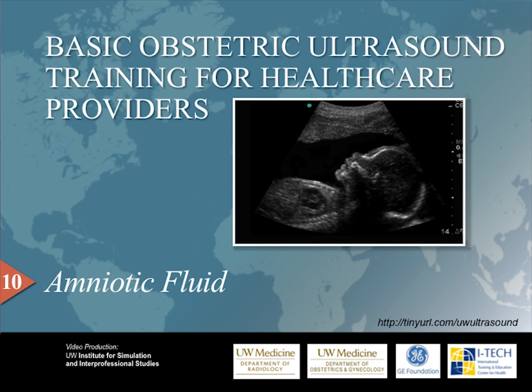My name is Dr. Christina Adams Waldorf, and I will be narrating this 10th video in our Pregnancy Ultrasound series. This video will focus on the amniotic fluid. Please visit our website for access to all of our video and training materials.